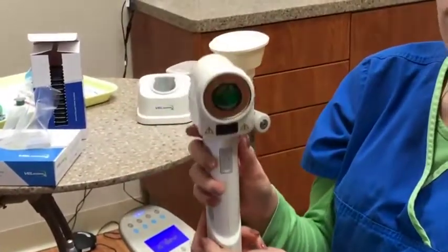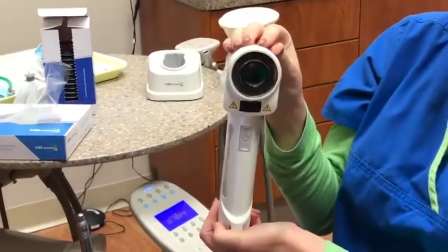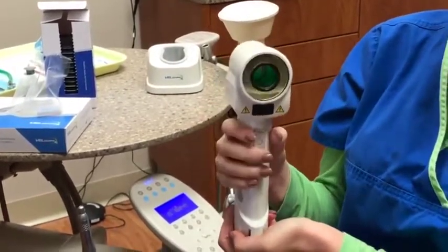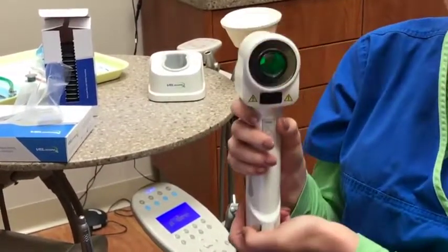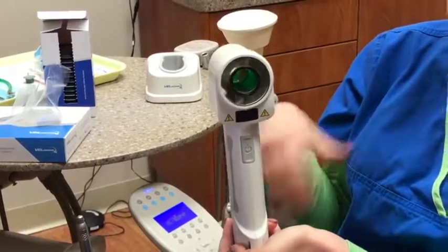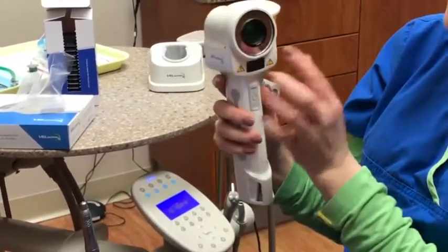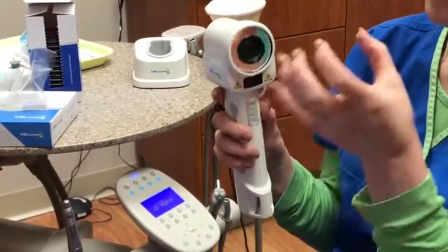Now we are left with our full Valscope down to its bare minimum. There's a little bit of contradiction in Valscope's writings — some say that you can use something like a Caviwipe or Birex to wipe down the outer surface to make sure it's clean, but also on their website it says that you cannot. My personal preference is I always wipe this down with a Caviwipe. By doing that you're also preventing cross-contamination and allowing the product to stay nice, clean, and ready to go for the next patient. You never want to wipe this area since this is where the filter is — that is why the lens is so thick.